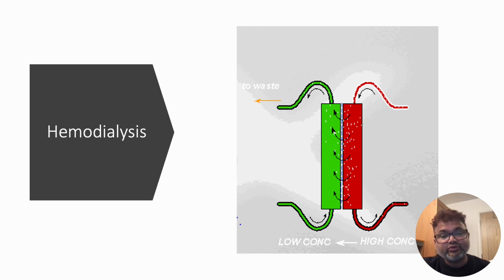And when we use continuous hemodialysis mode like CVVHD, which is called continuous veno-venous hemodialysis, then we use this mechanism.